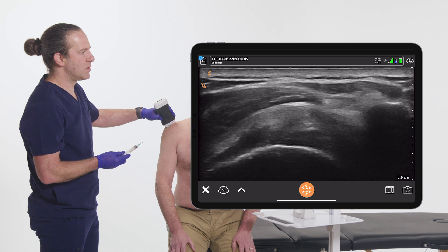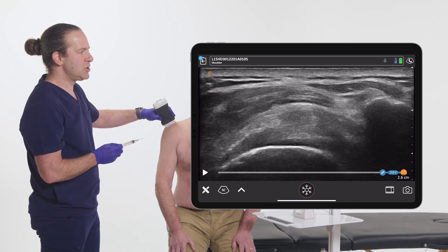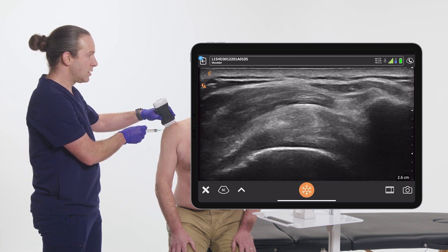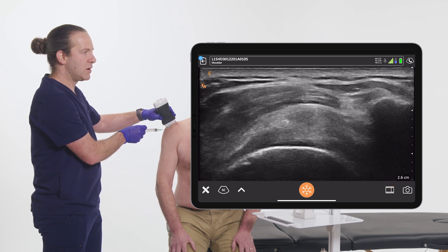Decrease depth. Or I can freeze, capture image, freeze. Or while I'm actually doing my procedure, capture video, freeze.